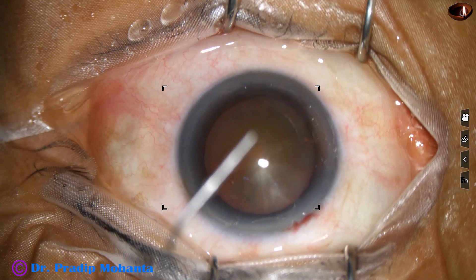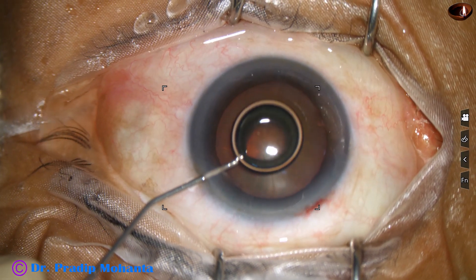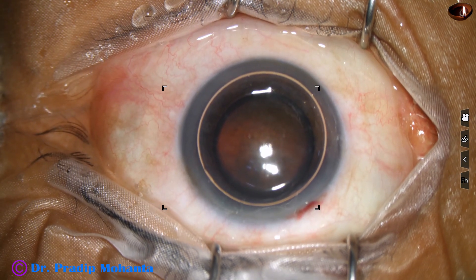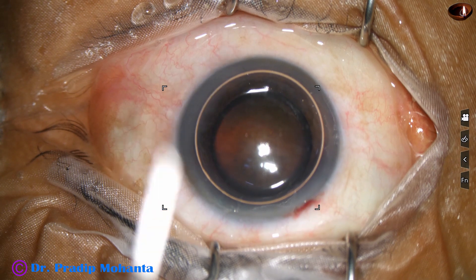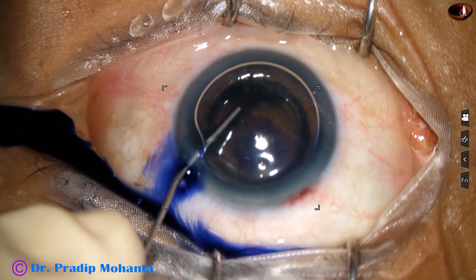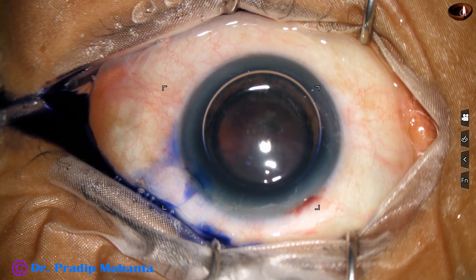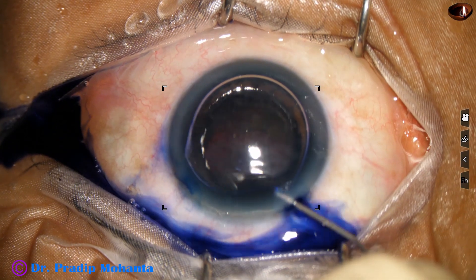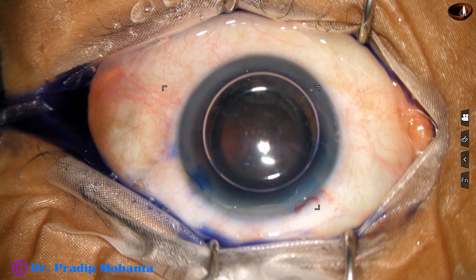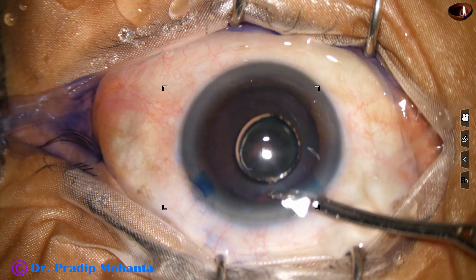In this case, I am going to manage with only one side port. An air bubble is injected to fill out the anterior chamber. Beneath this air bubble, trypan blue dye is applied over the anterior capsule in such a way that the dye touches all parts of the anterior capsule. If we apply the dye underneath an air bubble, staining is very quick and very nice.